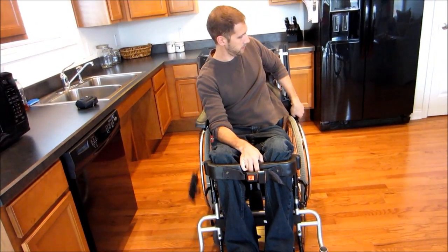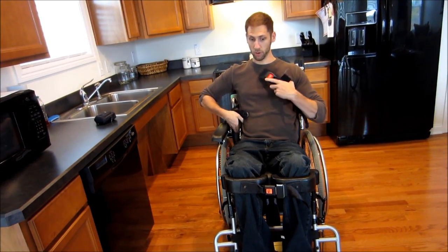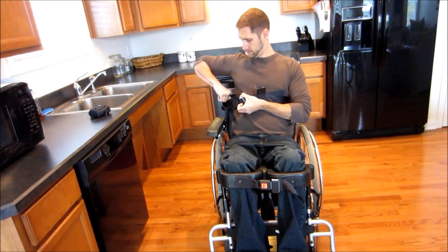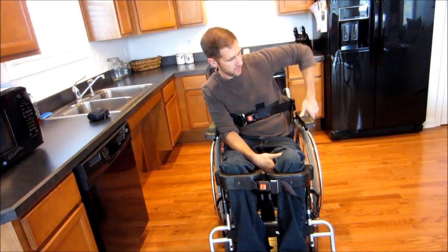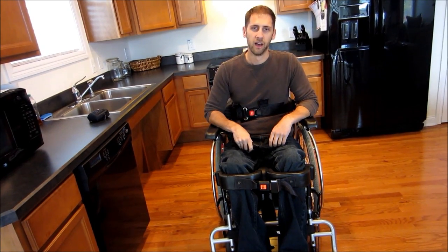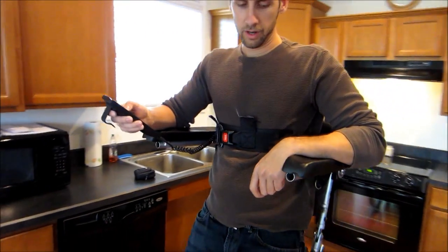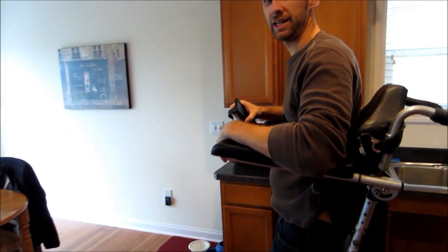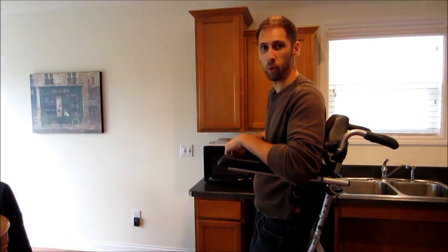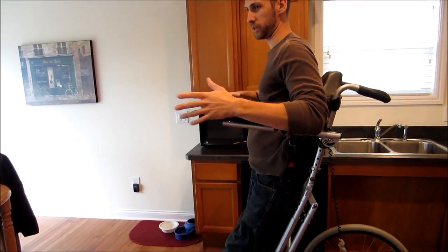So I'll usually just fold this down. It has a chest strap that comes across, and this keeps you from falling forward when you're actually standing up. And I usually just fold this down. And all you have to do is push a button. So once I get to the full incline position, come over here. I wanted to show you, I'm not standing a perfect 90 degrees. I think it's more like 85, I want to say. But the good thing is I am getting weight bearing on my legs. I can lean on these, which is pretty nice. Or if I want to, lean these up to reach for something, I can do that.